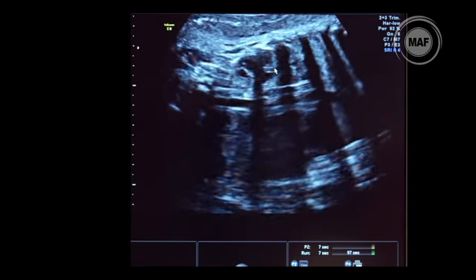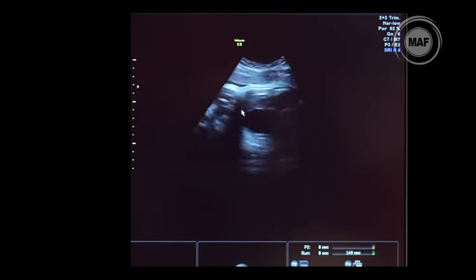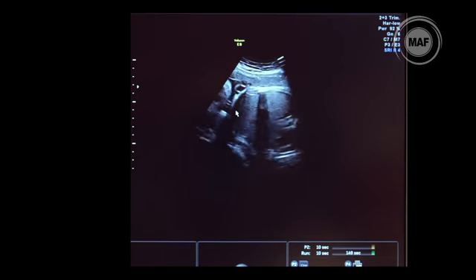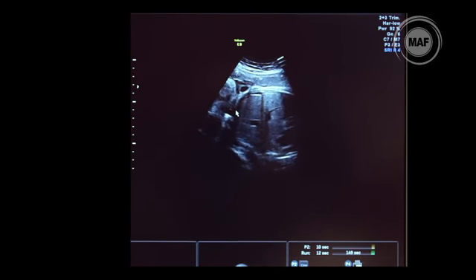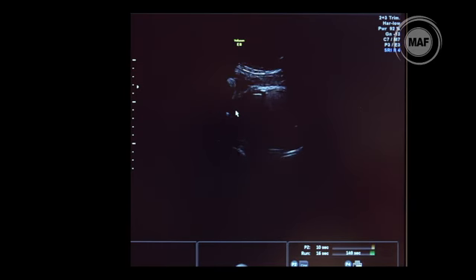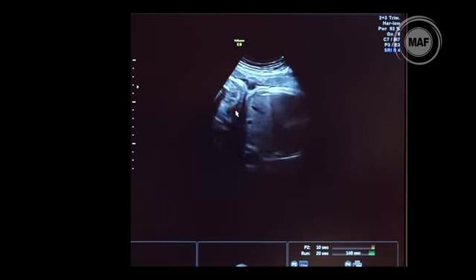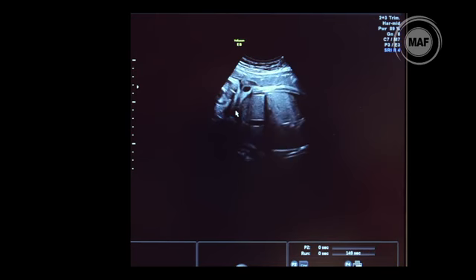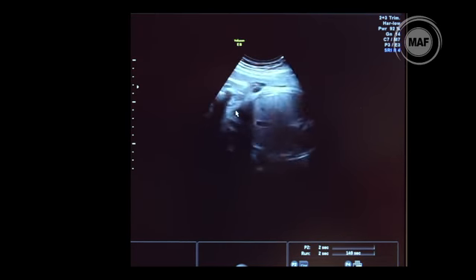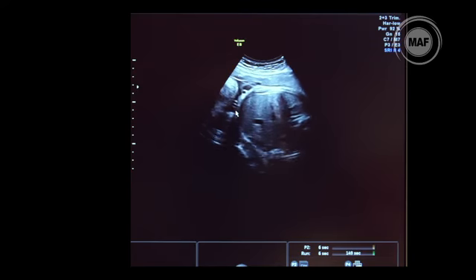Right? Or we can zoom out. It can be very small, difficult to see. Right there. Those are the shadows from the rib. Okay. And let's do the gain setting. So that's a little bit too dark. That's too bright. Okay. You see, that's what a gain does. Okay. So you want evenness of echoes. Just adjust it accordingly. You get nice even echoes, right?